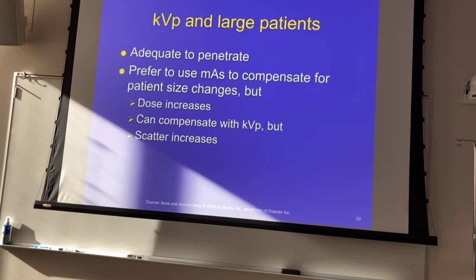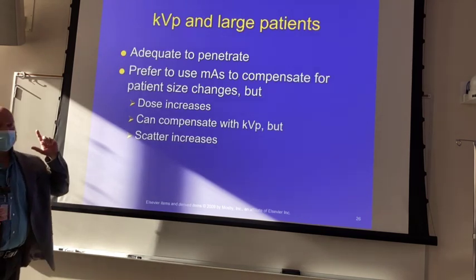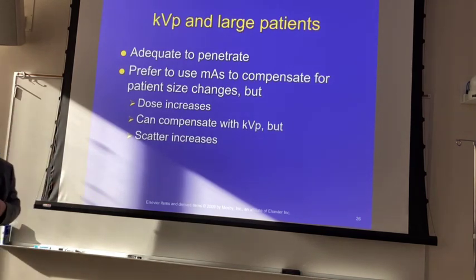and I think we're starting to see that because on the registry, according to the content specs that you are supposed to take the registry for, in the grid that describes the effects of different technical factors and equipment use on contrast and density, you don't see kVp affecting contrast at all anymore.